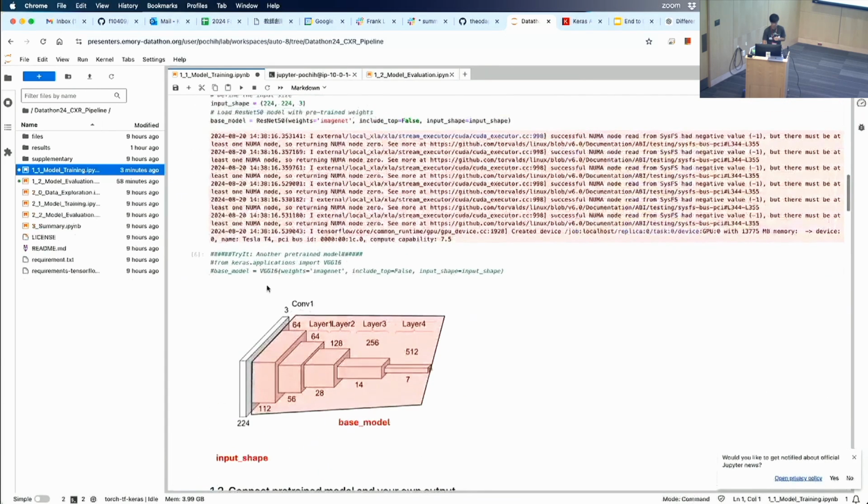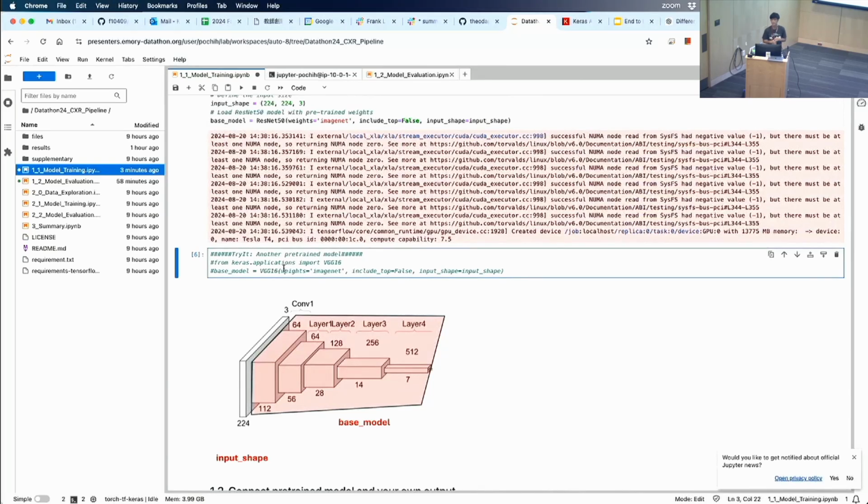Any other reason? Okay, if you're going to customize, you can customize it better in PyTorch. Yes. Why did you choose Keras? I think Keras or TensorFlow is suitable for beginners. Yeah, because you don't have to worry about too much code, too many hyperparameters, and you can simply build your model. So that's why we choose TensorFlow.